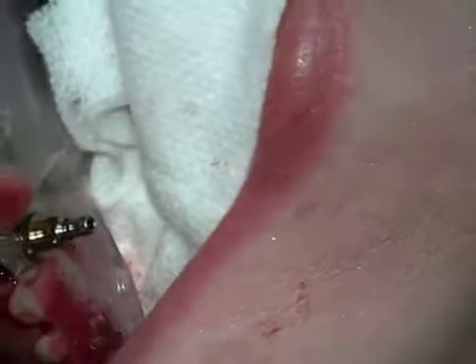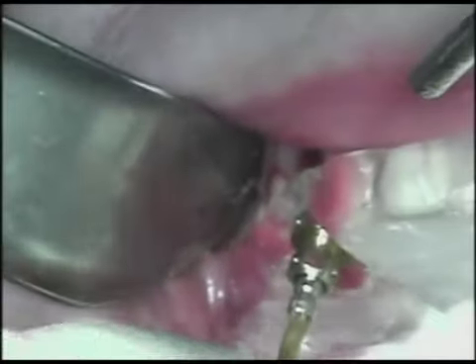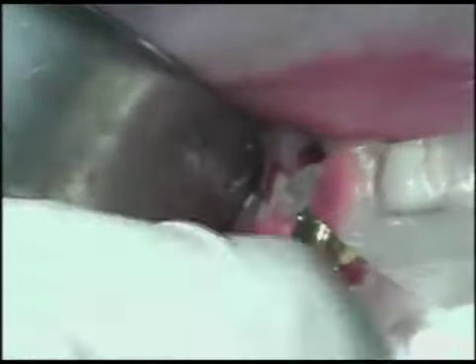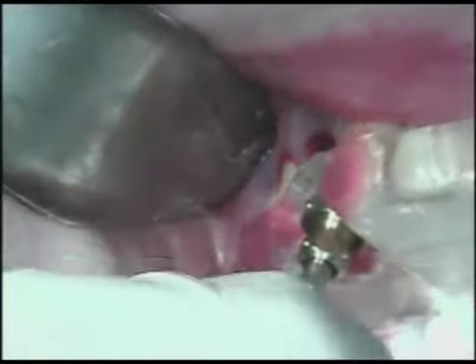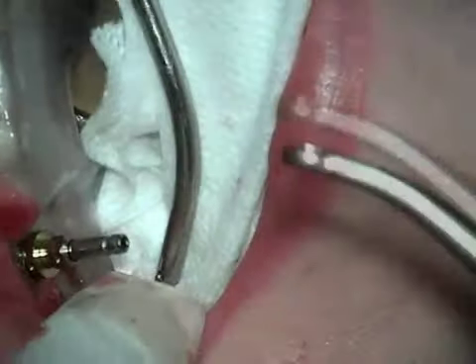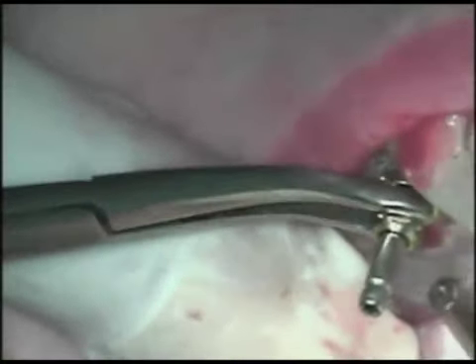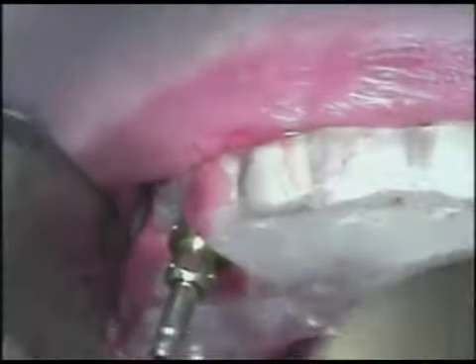Once we have the implant lined up and oriented correctly, we're going to go ahead and remove the implant mount. We just do that by hand with a Unigrip driver, and then we can take off the implant mount. Now sometimes the fit is so precise that it's very difficult to get these implant mounts off. So what I'm going to end up doing here is just taking the implant mount and the surgical guide out all in one piece, because I couldn't really separate them. It just doesn't want to move. Since we've backed off the screw, we're just going to take the surgical template and the abutment all out in one piece.